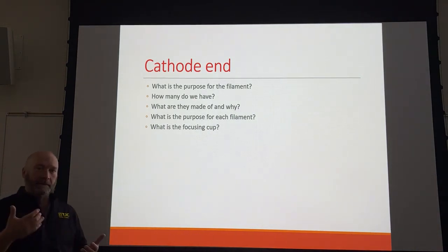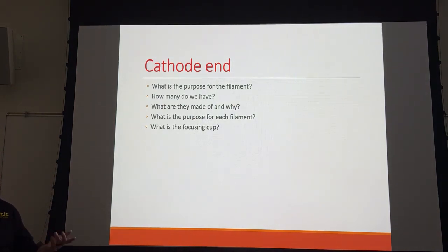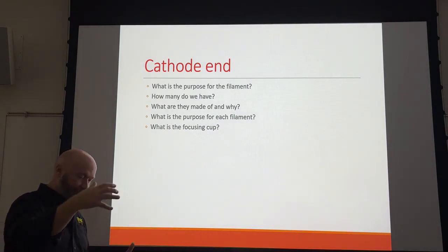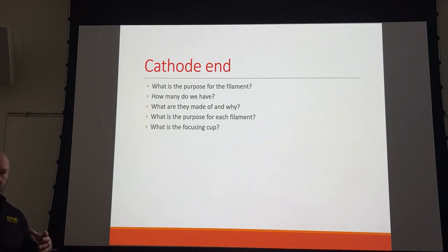Because whenever we hit the x-ray tube with high voltage, because those are all negative charges, if we don't have something trying to compress them and keep them close together as they travel across the tube, I used this analogy last semester. You drop a bowling ball in a mud puddle, and where's the mud going to go? Everywhere, right? The electrons are going to go everywhere. But if you keep them compressed, it's like you drop the bowling ball in, I don't know, you've got mud in a trash can for whatever reason. Is that trash can going to keep those droplets of mud from going in specific directions? The answer is yeah. Okay.